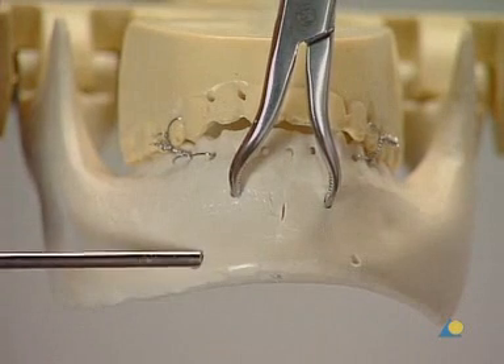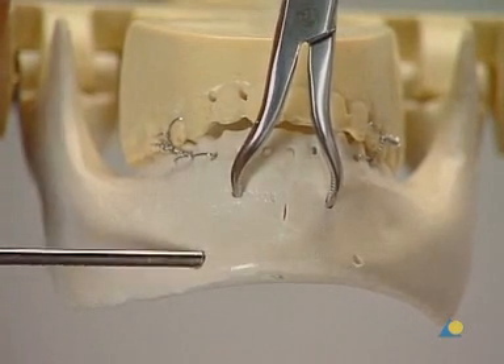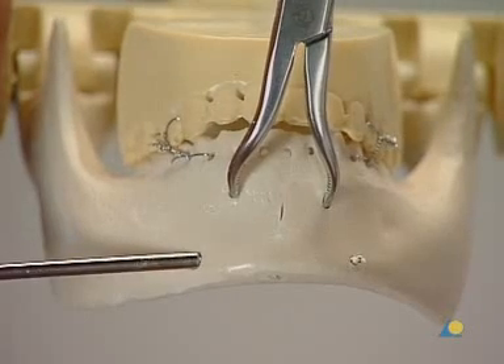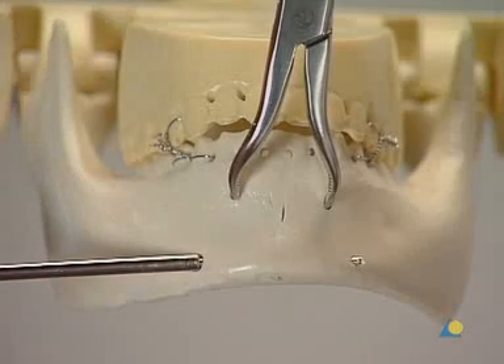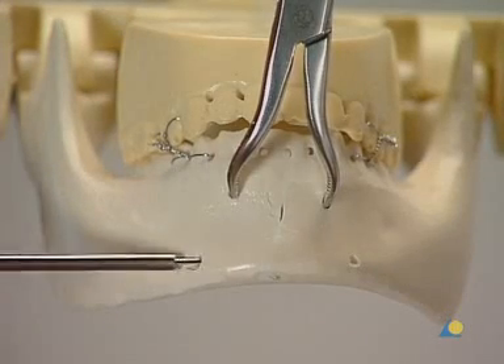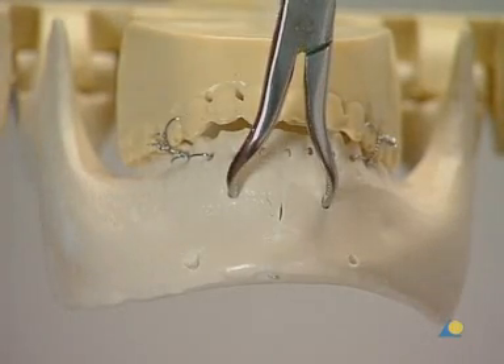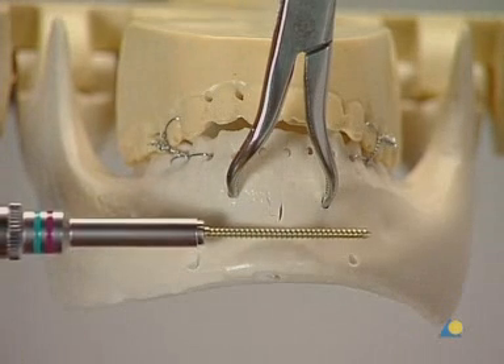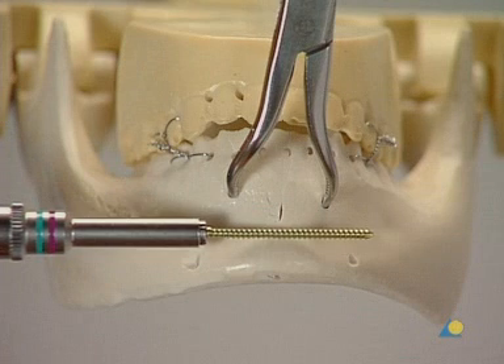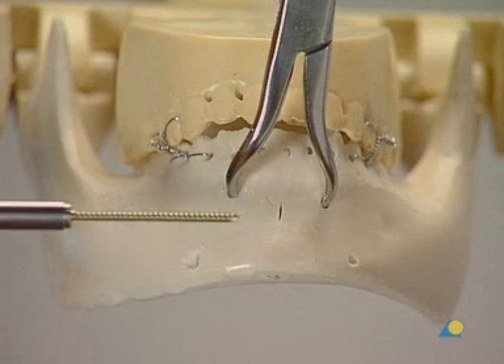The screw length is determined with the depth gauge. When using the lag screw technique, 2 mm are added to the measurement to ensure that the cortex will be fully engaged by the screw threads. In this exercise, the bone is not tapped. However, some surgeons feel that tapping is indicated in dense symphysial bone.